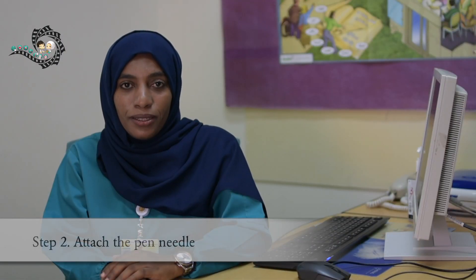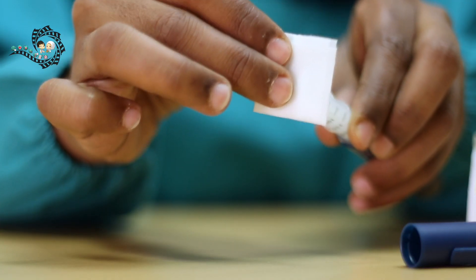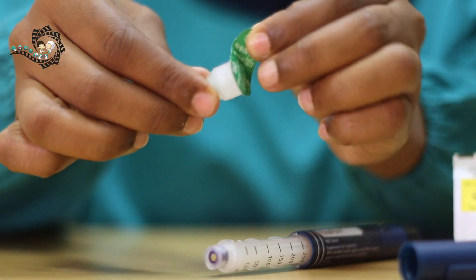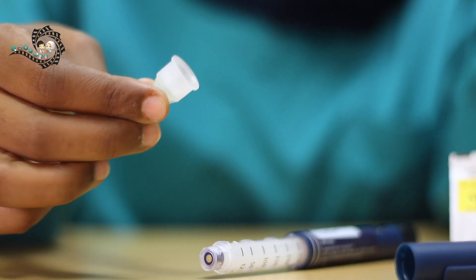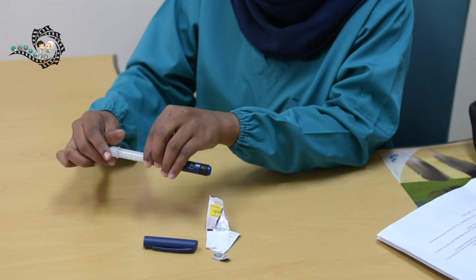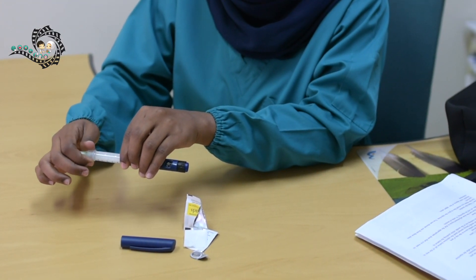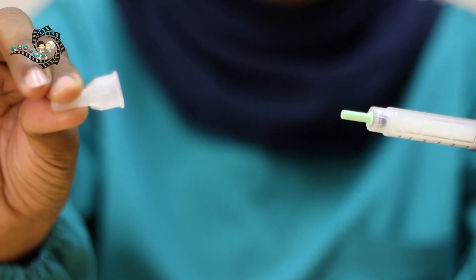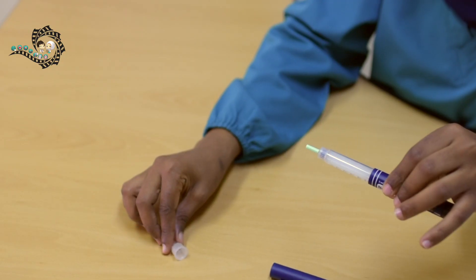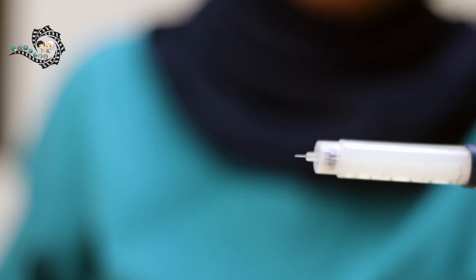Step 2: Attach the pen needle. Take an alcohol swab and wipe the needle attachment point. Take a new pen needle and remove the protecting seal. Attach the needle to the pen by pushing the needle straight onto the pen. Turn the needle in a clockwise direction until it will not turn anymore. Remove the outer cap of the needle and keep it — you will need it after the injection. Then remove the inner cap and discard it.